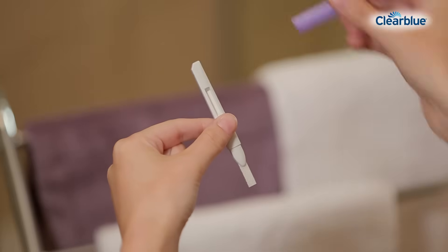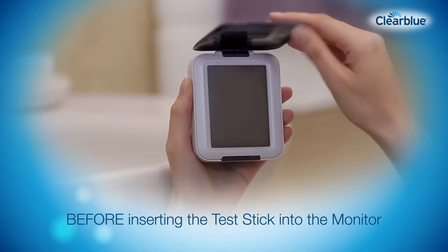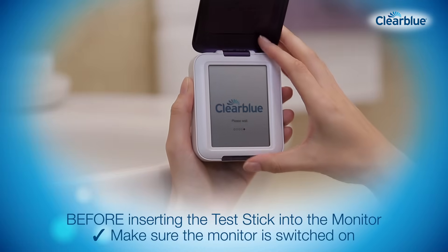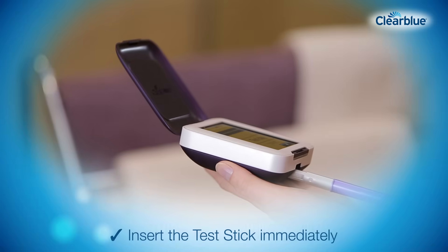Next, take the cap off the handle and place it over the wet end of the test stick. Before inserting the test stick into the monitor, make sure the monitor is switched on and wait for the Clearblue screen to disappear.